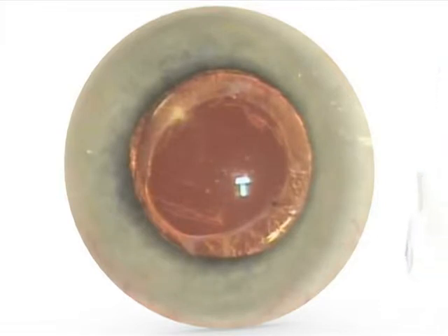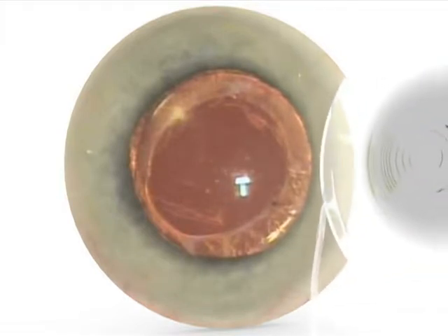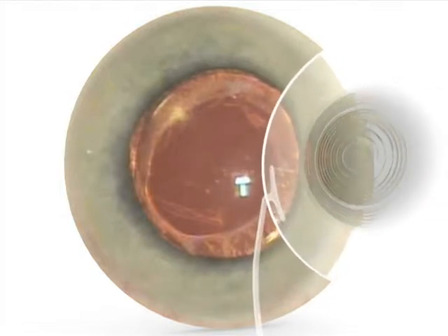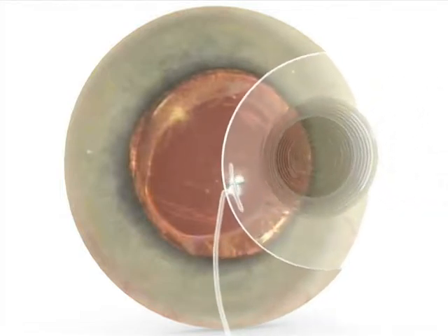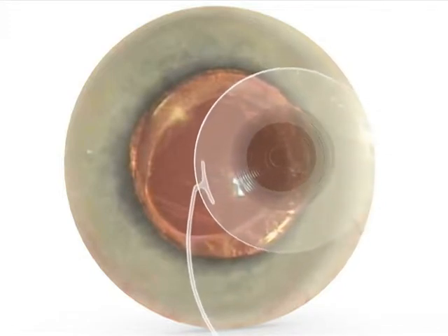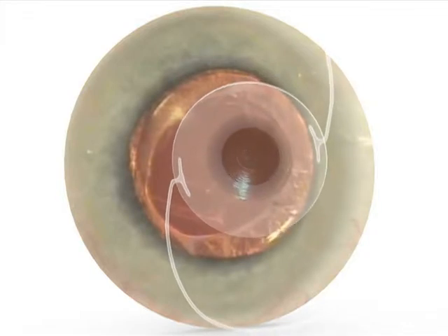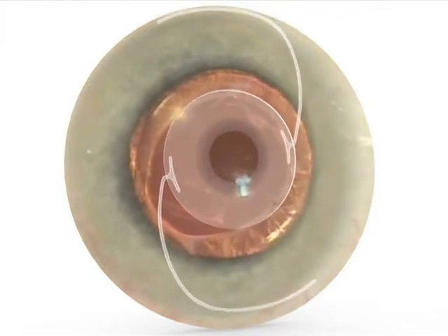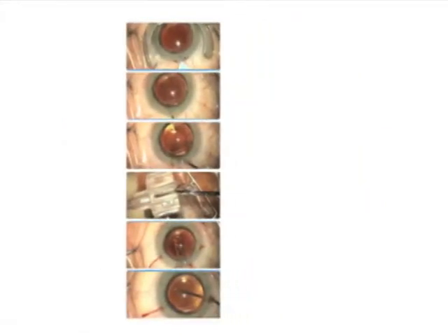We plan instead to leave the monofocal IOL in place and place an add-on diffractive IOL in front of the capsular bag IOL. This special add-on IOL needs to fulfill two tasks: to correct the remaining refractive error regarding distance, and to provide reading ability up close.